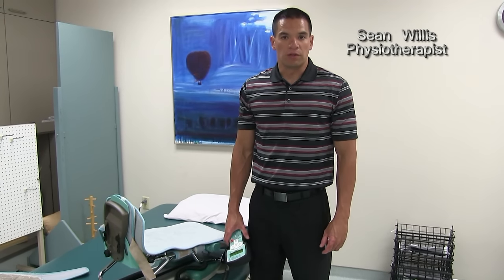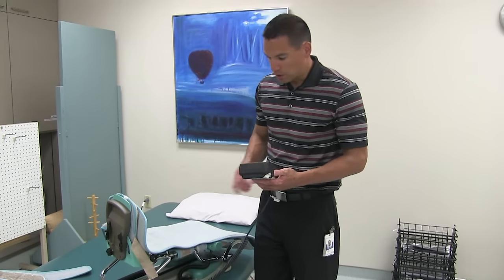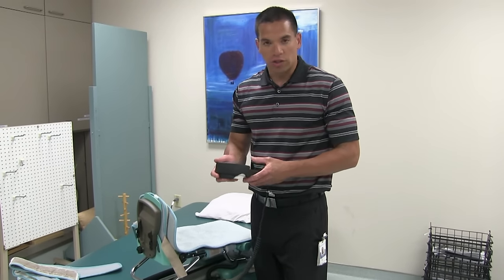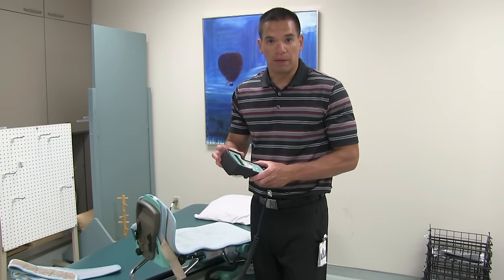My name is Sean Willis, a physiotherapist at University Hospital London Health Sciences Centre, and today we're going to go over how to adjust and put on a CPM machine. This particular CPM machine is manufactured by Kinetech, so some of the instructions in terms of the remote and electronics will be specific to this unit, but for the most part they're fairly generic to most CPM machines.